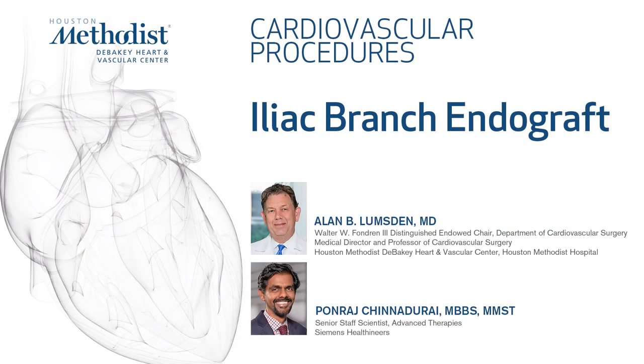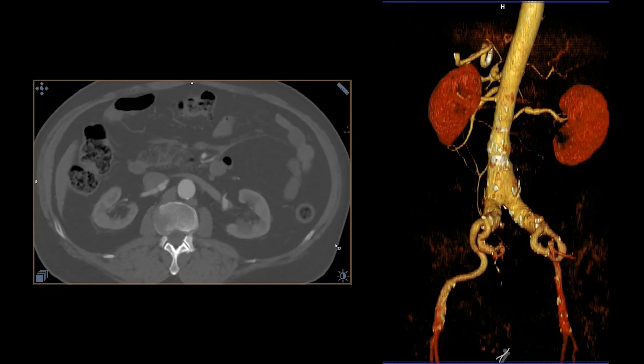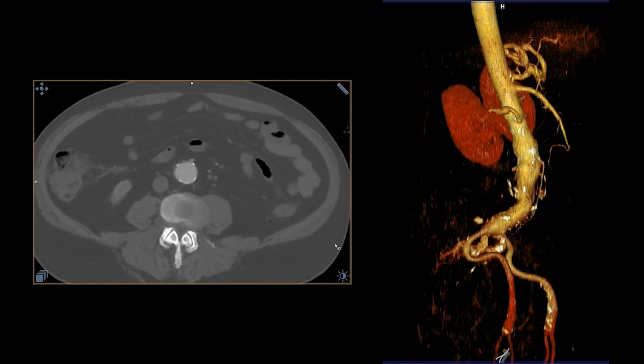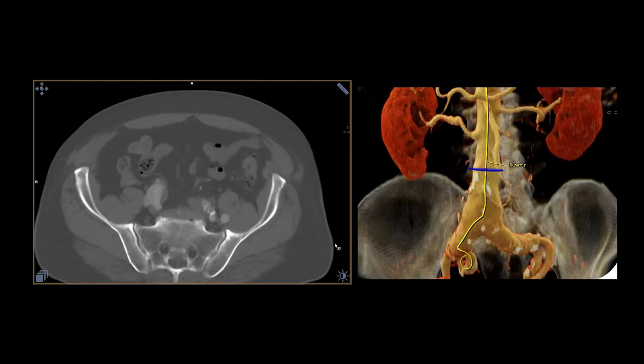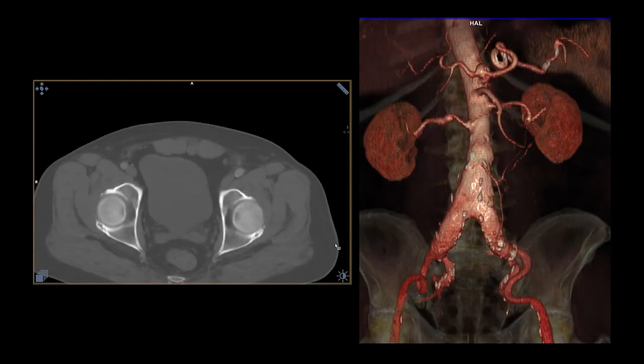We're going to demonstrate the use of the Gore Iliac Branch Endoprosthesis in a patient who had a 4.7cm abdominal aortic aneurysm, a right common iliac which enlarged to 3cm, and a left common iliac dilation of about 23mm. The plan was to place a bell bottom on the left side and an iliac branch device on the right side.